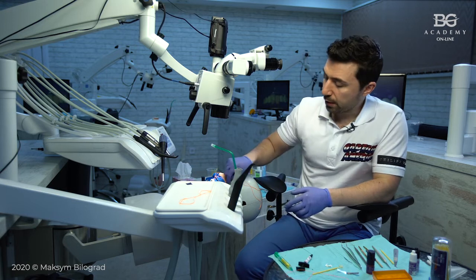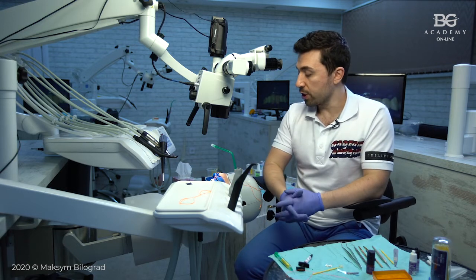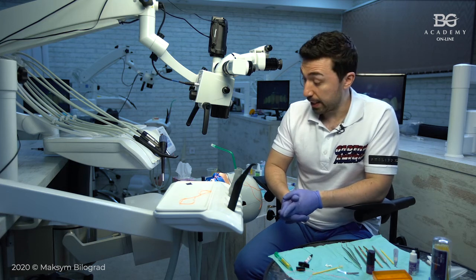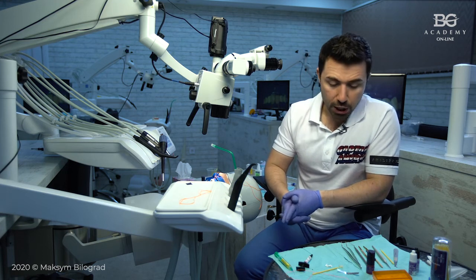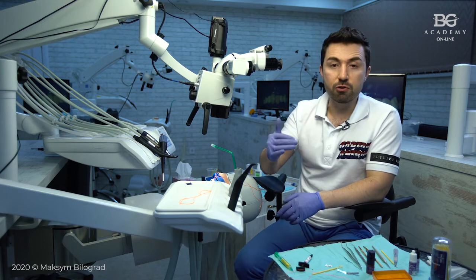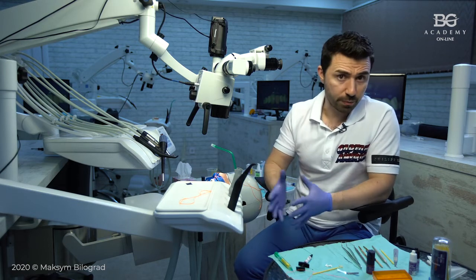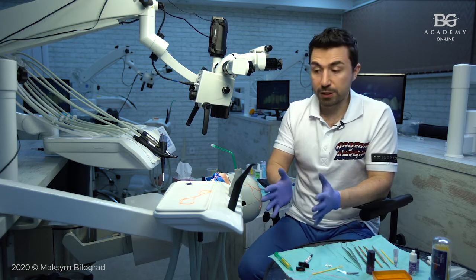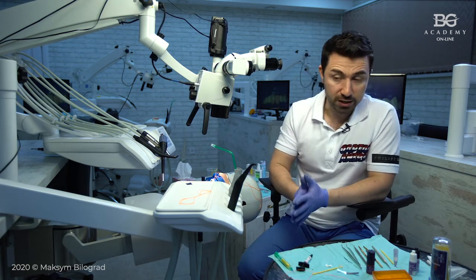In case you do, for example, IDS, immediate dentin sealing, at the day of preparation, you may get a really low percentage of postoperative sensitivity because the dentin will already be sealed with adhesive resin.